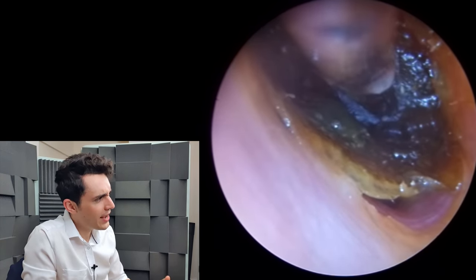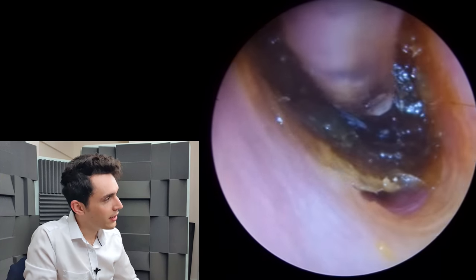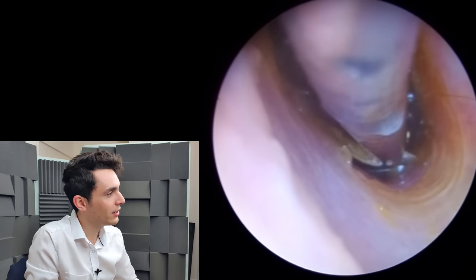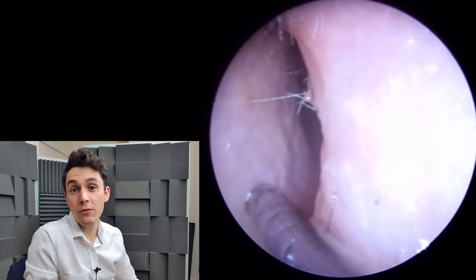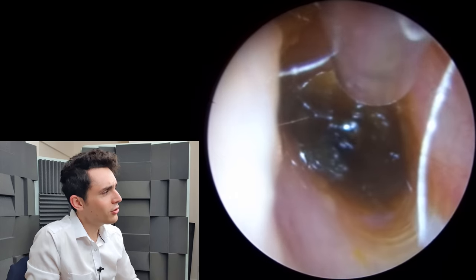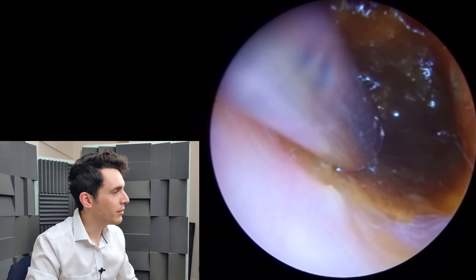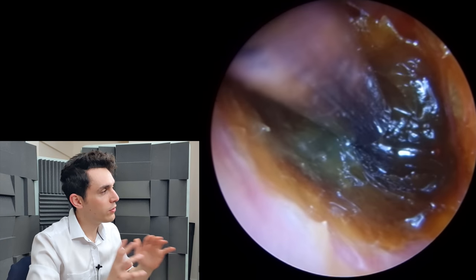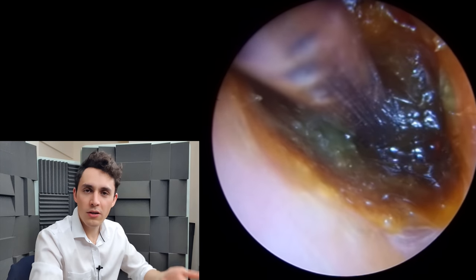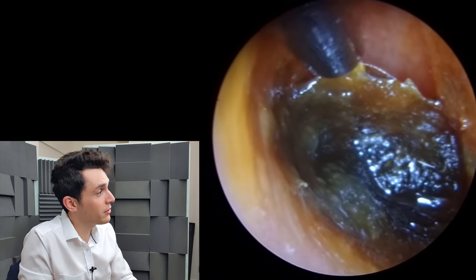The patient was fairly tolerant. Throughout the procedure I kept asking, 'Is this okay? Is this hurting?' He put on a brave face — I could tell he was finding it a little uncomfortable, but as far as I could tell it wasn't hurting him. So I've applied some olive oil here, just in the hopes that it will lubricate the canal and maybe some of the oil will creep behind the plug of debris and just kind of lift it a little bit. But at this point I'd sort of run out of ideas, to be quite frank.